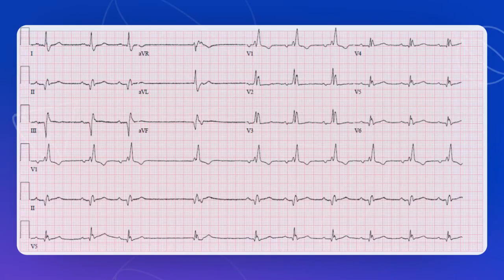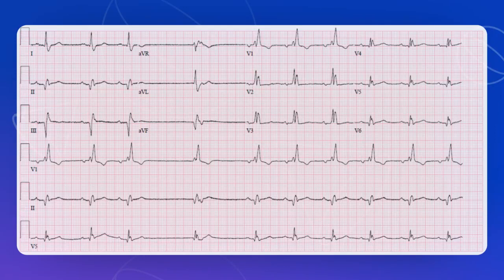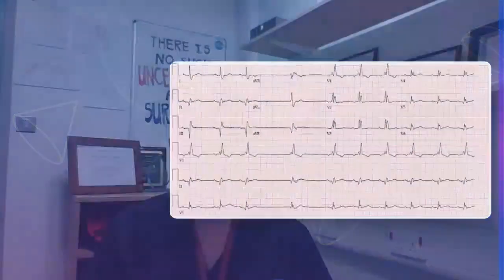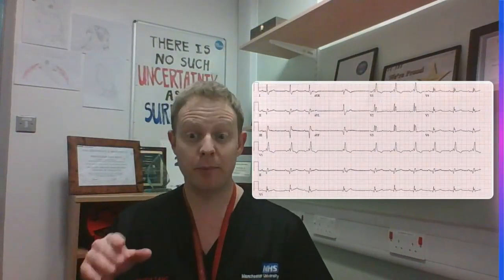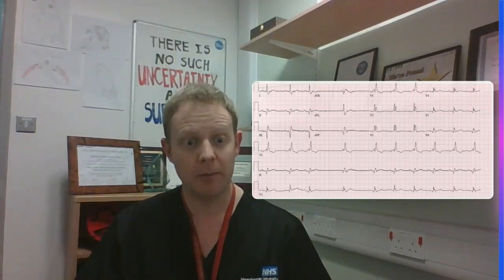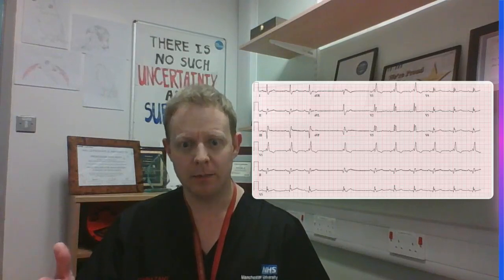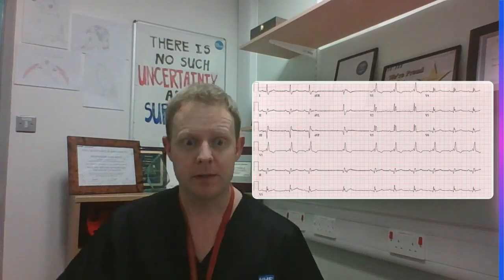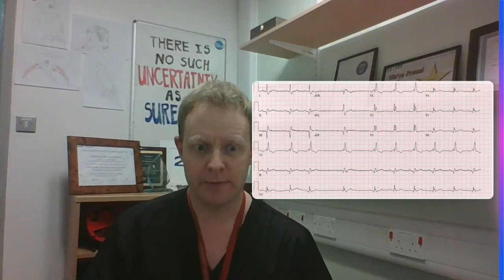Now let's look at the PR interval — it's prolonged, over 200 milliseconds, over one big square. So this is trifascicular block. It's a famous misnomer because trifascicular block doesn't mean you've blocked three fascicles — if you block all three fascicles you've got complete heart block. What it actually means is you've got AV block as well as two fascicles blocked, which is exactly what we've got here.